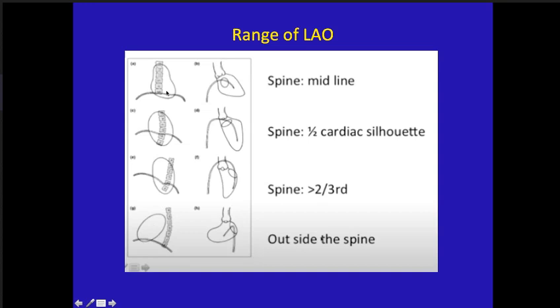Now, why am I telling you this? Because I already told you how to identify oblique view with the chest X-ray, isn't it? Why am I telling you this? Because when you do an angiogram, you tend to reduce the field of interest. You don't get clavicles, ribs, everything in an angiogram. You get a much more limited view when you do an angiogram because that improves the quality of angio. Now, look at this view.